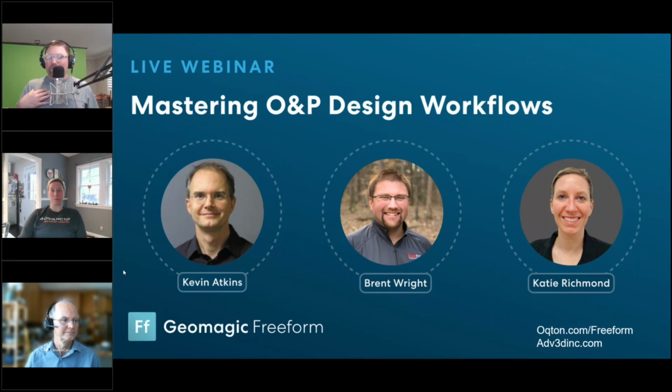But I would say, unless you just have money burning a hole in your pocket, start with Freeform, and then when you need those assemblies and some other tools that come along with Freeform Plus, like the Dynabot and that sort of thing, then you make the jump to Freeform Plus, and there's no penalty to do that. You just literally pay the difference of Freeform Plus and Freeform, and now you're in Freeform Plus. But I think it's important to do the tools in Freeform first, learn the flow. It's not going to hold you back, and then you will just love Freeform Plus that much more.